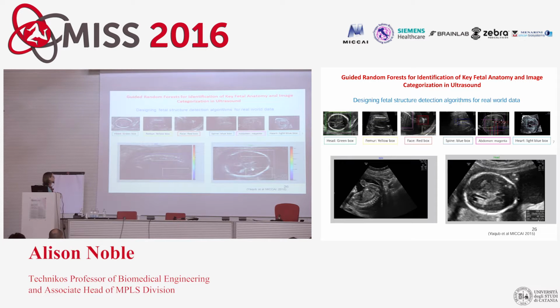So it's a challenging problem that prior to machine learning, I don't think you could really attempt to solve. That's because of the appearance of the images. But with machine learning, and being able to use the power of that to build knowledge of what the characteristic patterns are, then you can start to analyze the data.